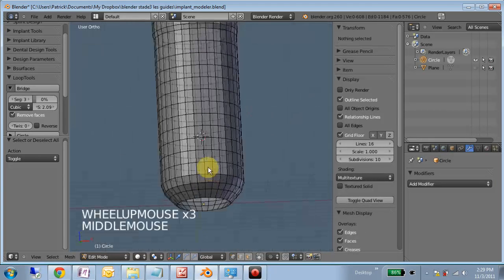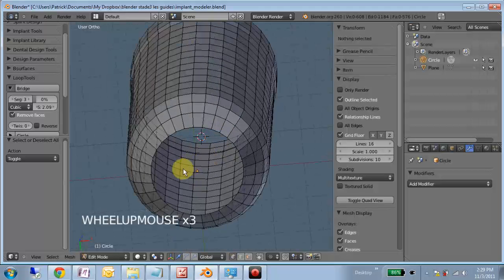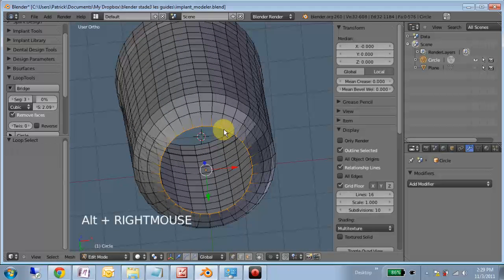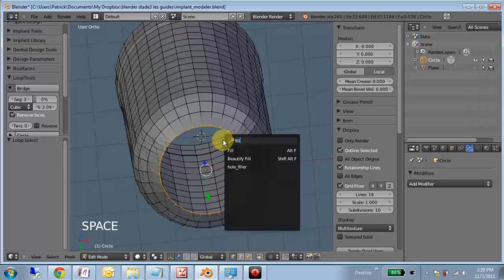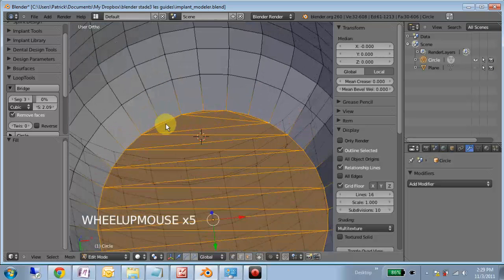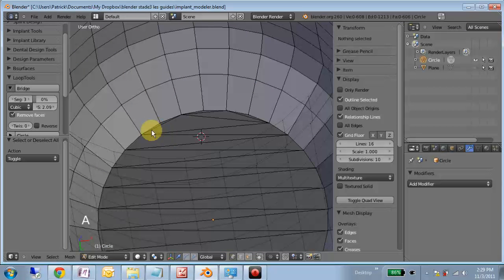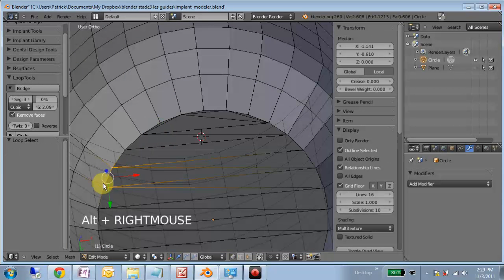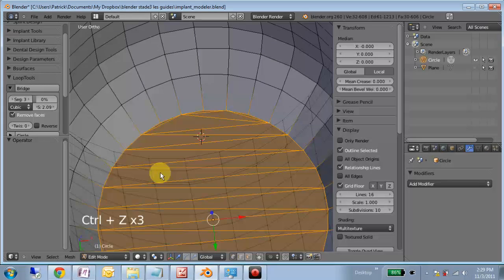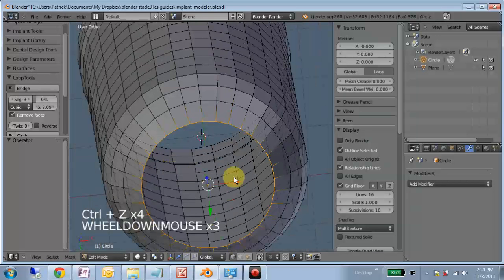So I will come down here, and there's two ways to close this bottom. You can select this ring with loop select and simply fill. The problem is that kind of crisscrosses everything, and if we ever want to come back and gain access to the outer loop, it's very difficult. Notice if I hold Alt and select here, it no longer selects the ring. So I'm going to undo that. Show you a different trick.